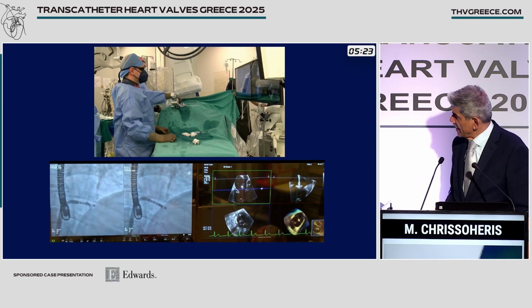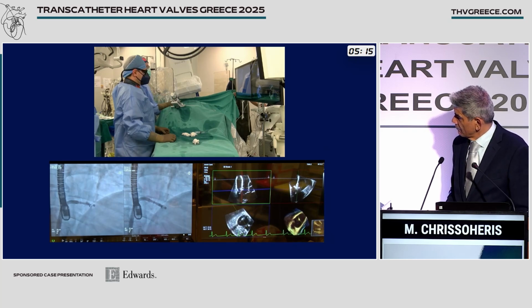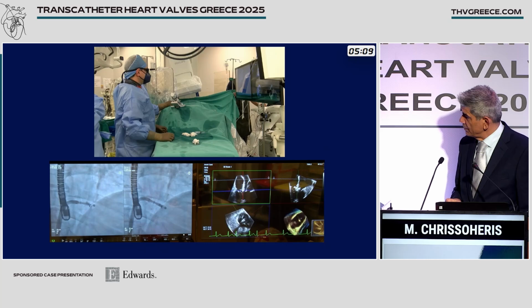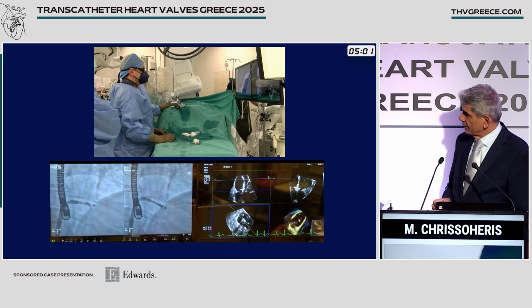Here we also check the clasps, which one is the septal and which one is the lateral one. It's very important, as mentioned before, to have good coaxiality to the valve plane and to be perpendicular to the coaptation zone that we're interested in. So we need to go more anteroseptal in terms of our position.